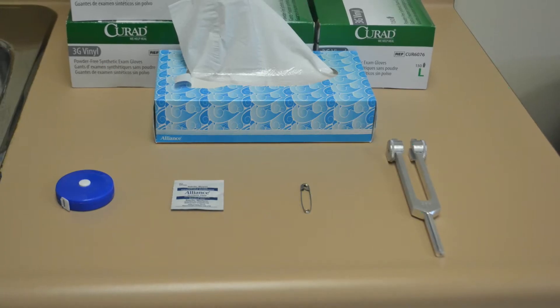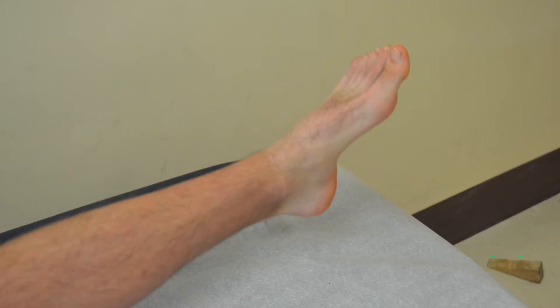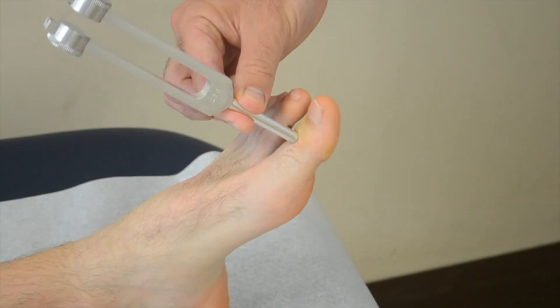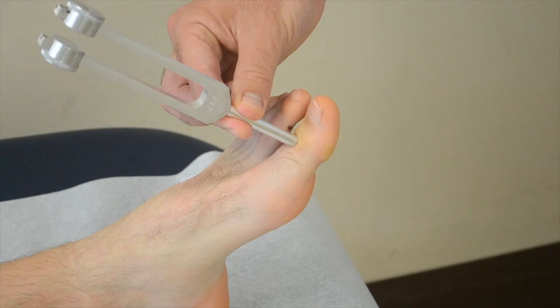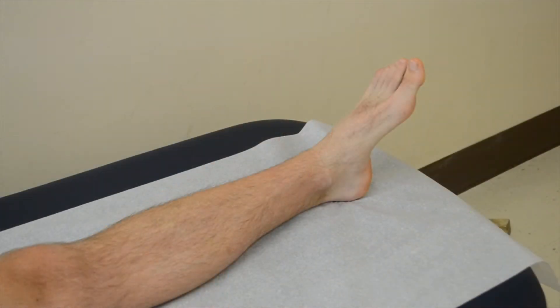Typically when testing vibratory threshold, a distal part of the extremity such as the interphalangeal joint of the great toe is used. First you will determine if the patient can feel the vibration at the joint, then you'll determine the patient's vibratory threshold.